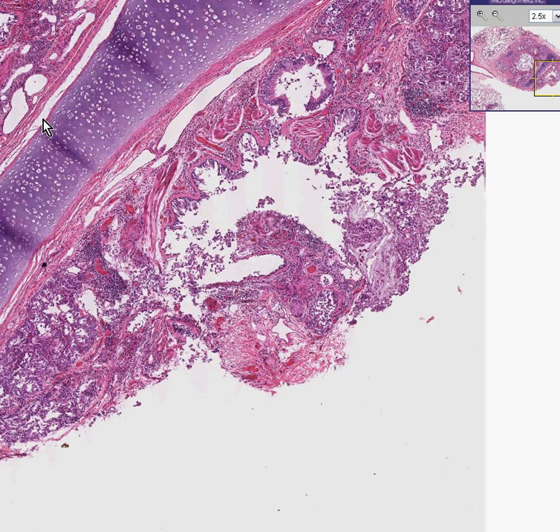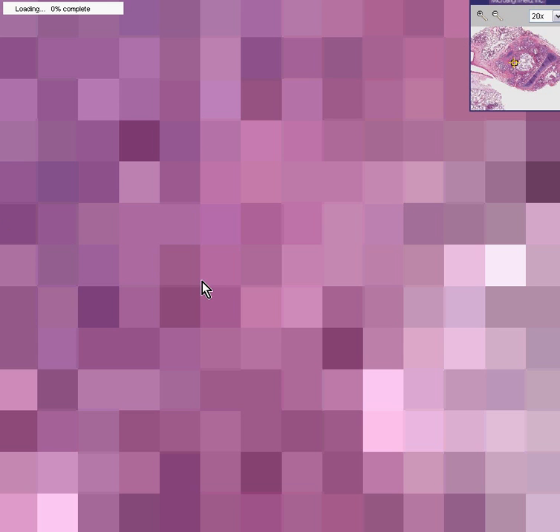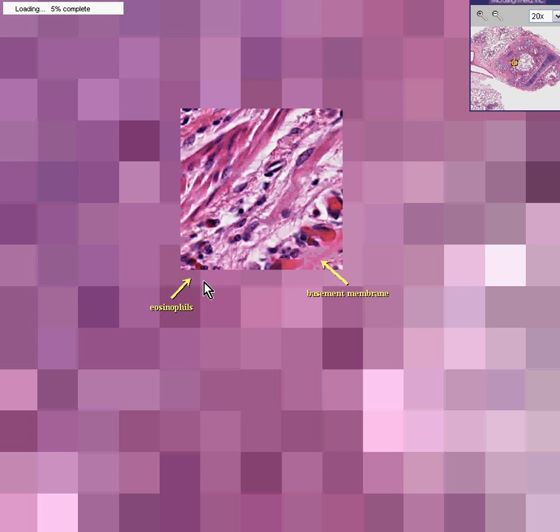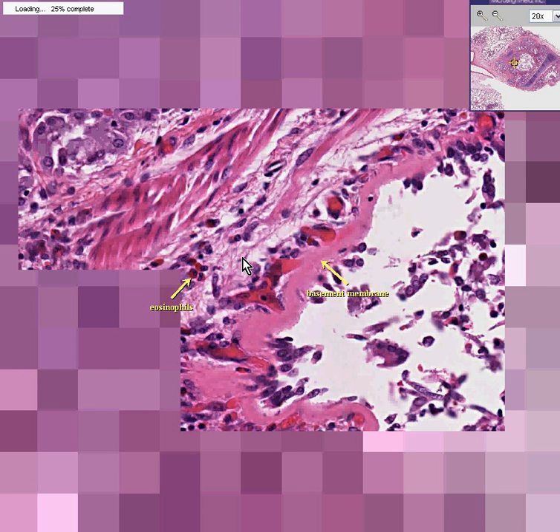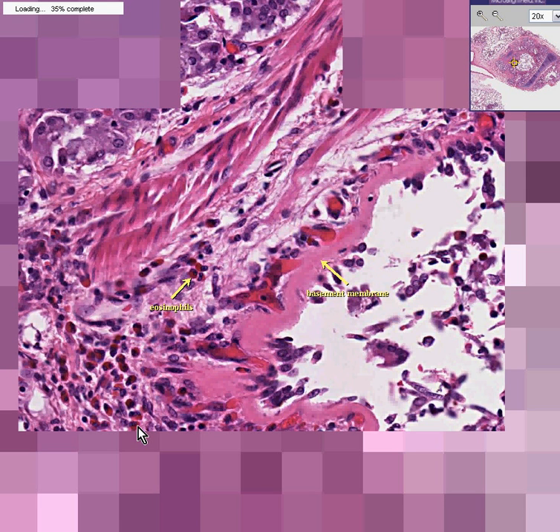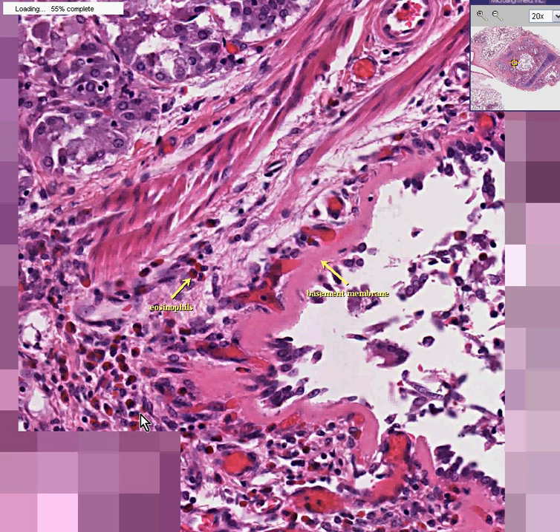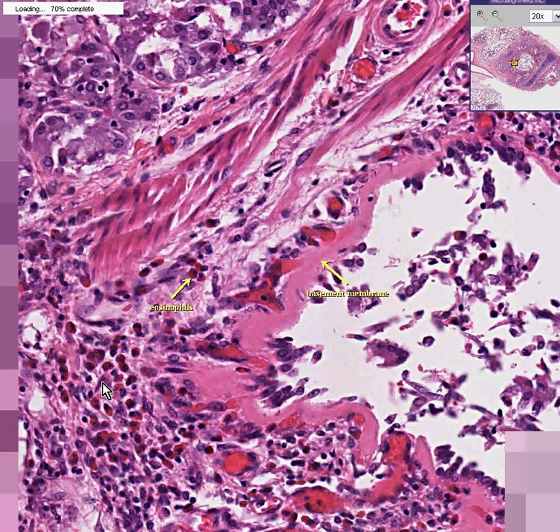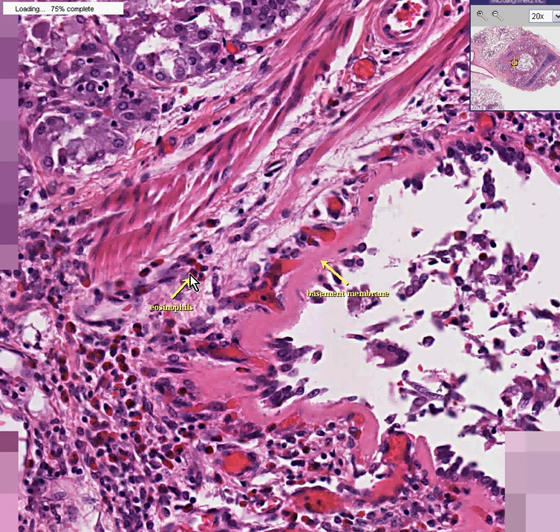Let's look at a couple of other features of asthma. Very often when you look at the inflammatory infiltrate in asthma, you'll notice a lot of these cells. Perhaps the majority of these cells here are multi-lobed cells, but they have very red cytoplasm. These are eosinophils. Eosinophilia is associated with allergies, just like asthma is also associated with allergies.